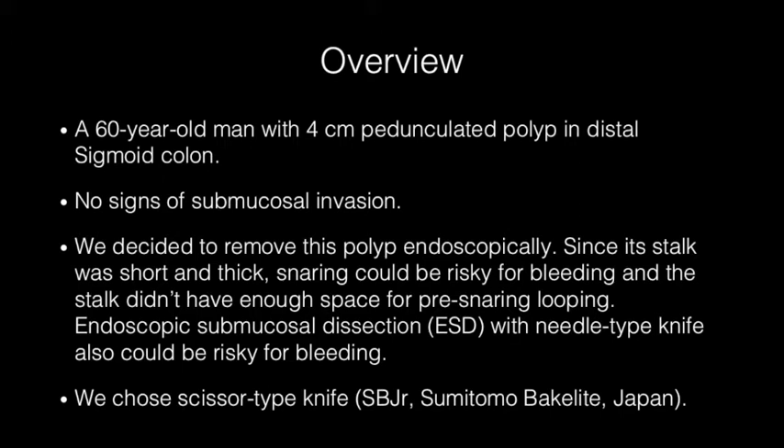Since the stalk of the polyp was thick, big vessels inside were anticipated. Direct snaring could be risky for bleeding and incomplete resection, and there was no space for an endo loop. The advantage of a scissor-type knife is that once you catch the submucosal layer with the knife, coagulation following cutting in one session is possible, by which you can avoid bleeding. Therefore, we chose a scissor-type knife called SP-Junior for this case.